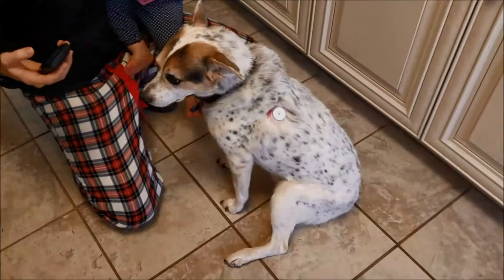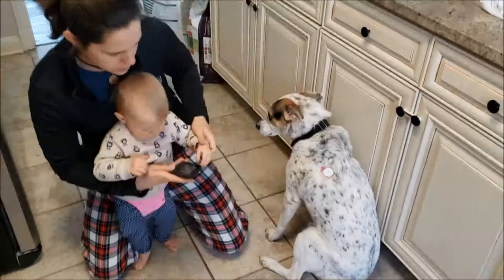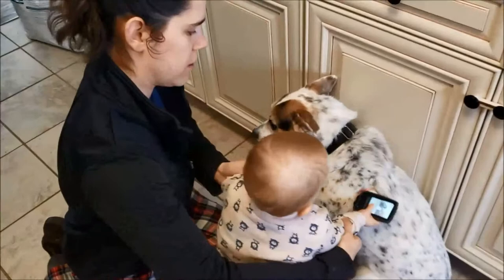We can do it with a baby too. All right, Charlotte, you ready? All right, you go. Good job, Charlotte. You got it. So easy a baby can do it.